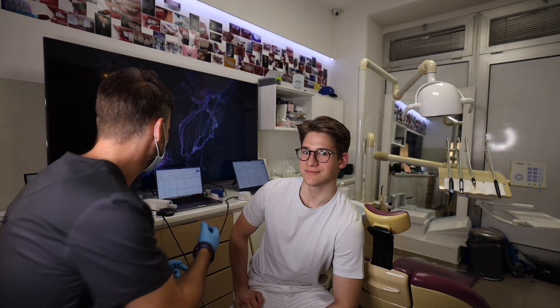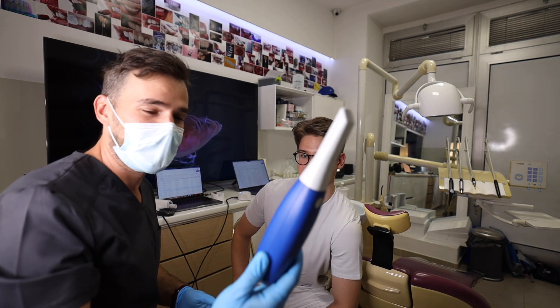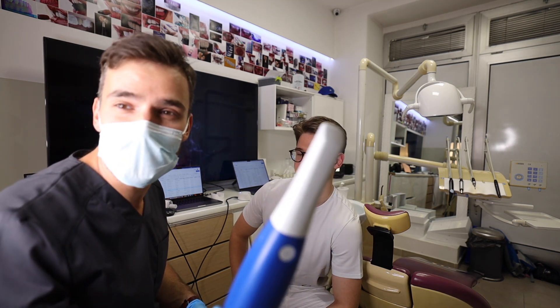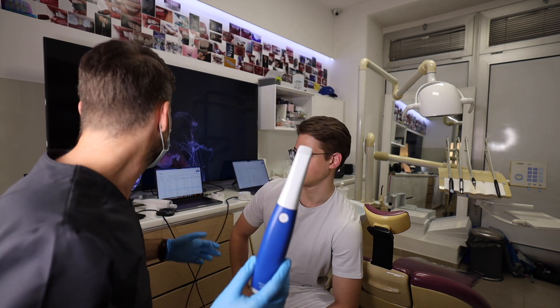We took a lot of scans and both scanners are really performing so well. But I'm really impressed with the i600 — it's light, it's small, and it works all the time. The price-performance factor is absolutely there. It is a truly best buy. This is the best scanner I've ever used in this price range. I really love the i700 wireless too.